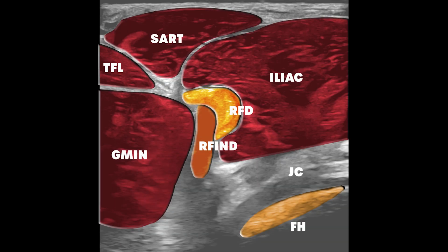Once the comet-shaped anisotropic tail becomes visible, the anatomical structure can be re-evaluated. At this level, note that the gluteus minimus muscle is positioned lateral to the rectus femoris tendon, located lateral to the tail.